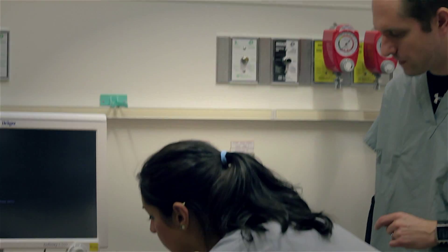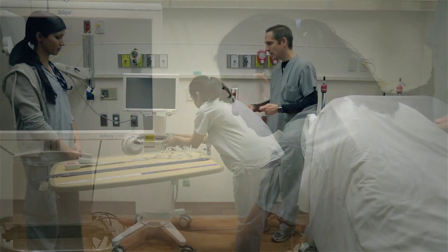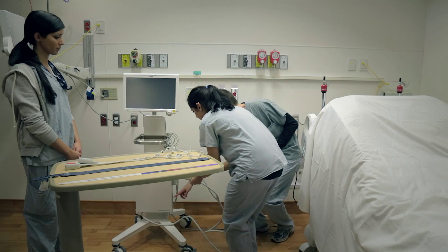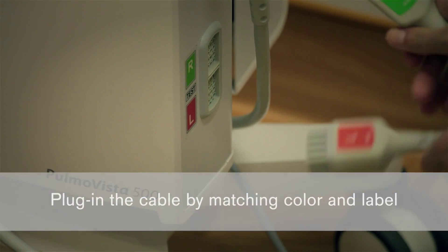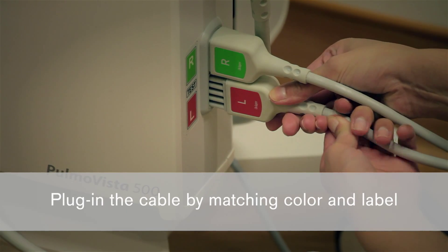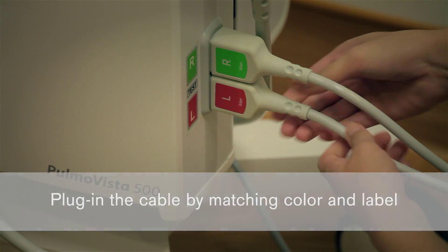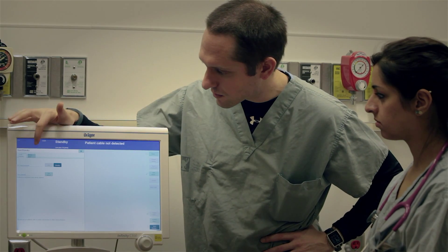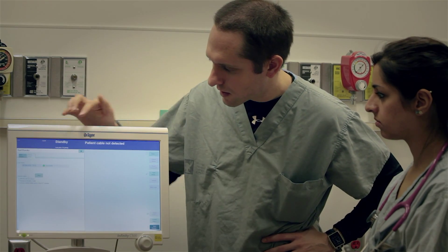While this is starting up, plug the cable in on the side. The easiest way to remember how to plug the cable in is to match the letters on the same side as the letters here. Make sure it's in snug. After the cable is plugged in, we can do the device check — select device check, and then start.